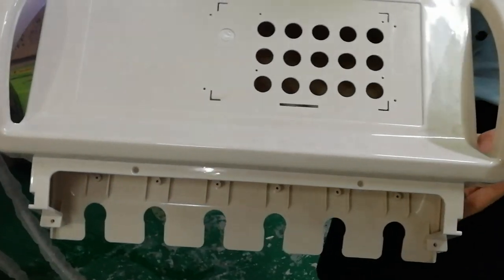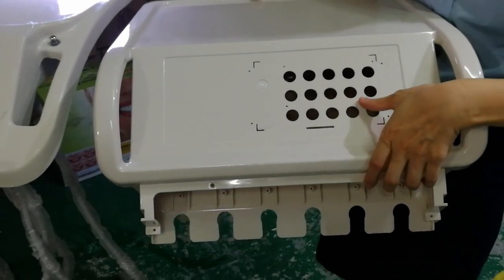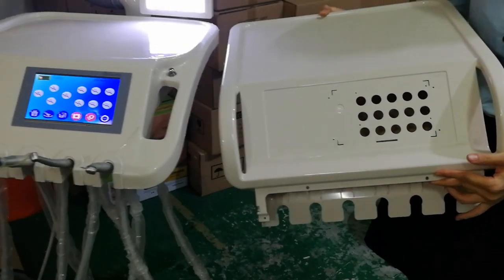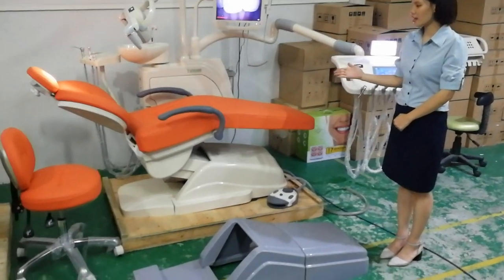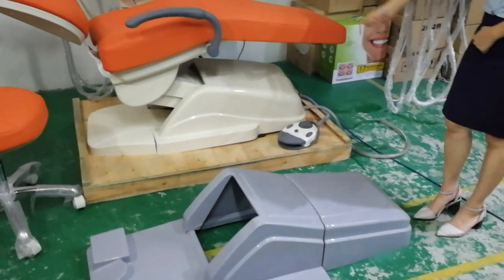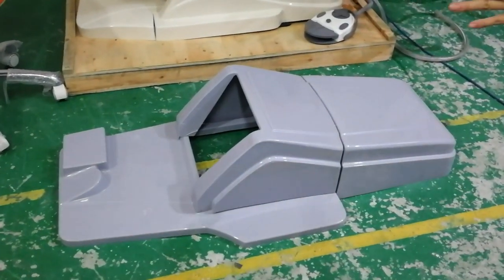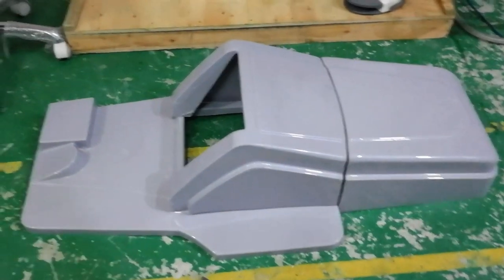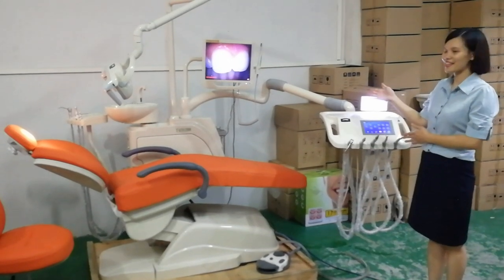For this part, dentists can operate by touch screen or by push button — both options are available. For the plastic base, we give two choices for dealers: the first option and the second, which is longer and makes the chair look more elegant. Nice to share with you this elegant dental chair. Thank you.